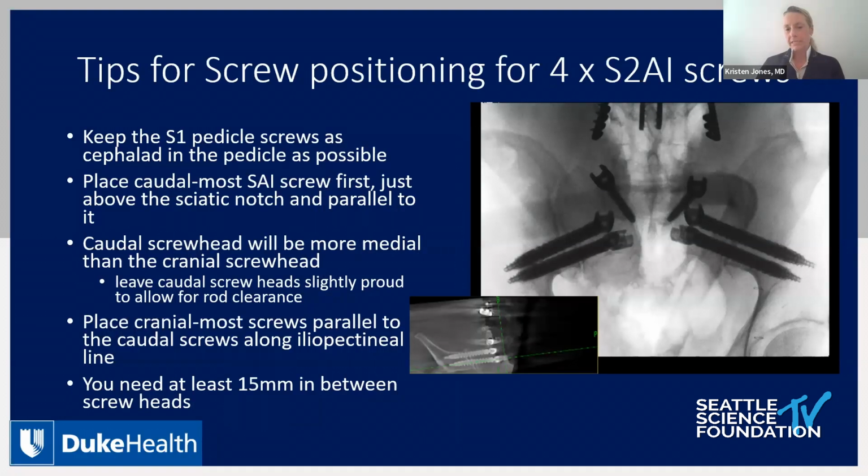And so the first thing that I usually think of is, the S1 pedicle screw can go almost anywhere. The S1 is a huge pedicle, but you really set yourself up for success of putting multiple points of pelvic fixation in, actually, when you're putting your S1 pedicle screw in. And I usually do put an S1 pedicle screw in with these dual points. I don't skip it. And I don't have great biomechanical evidence as to why. I don't think you absolutely have to have it, but certainly with this technique, you can easily accommodate it.